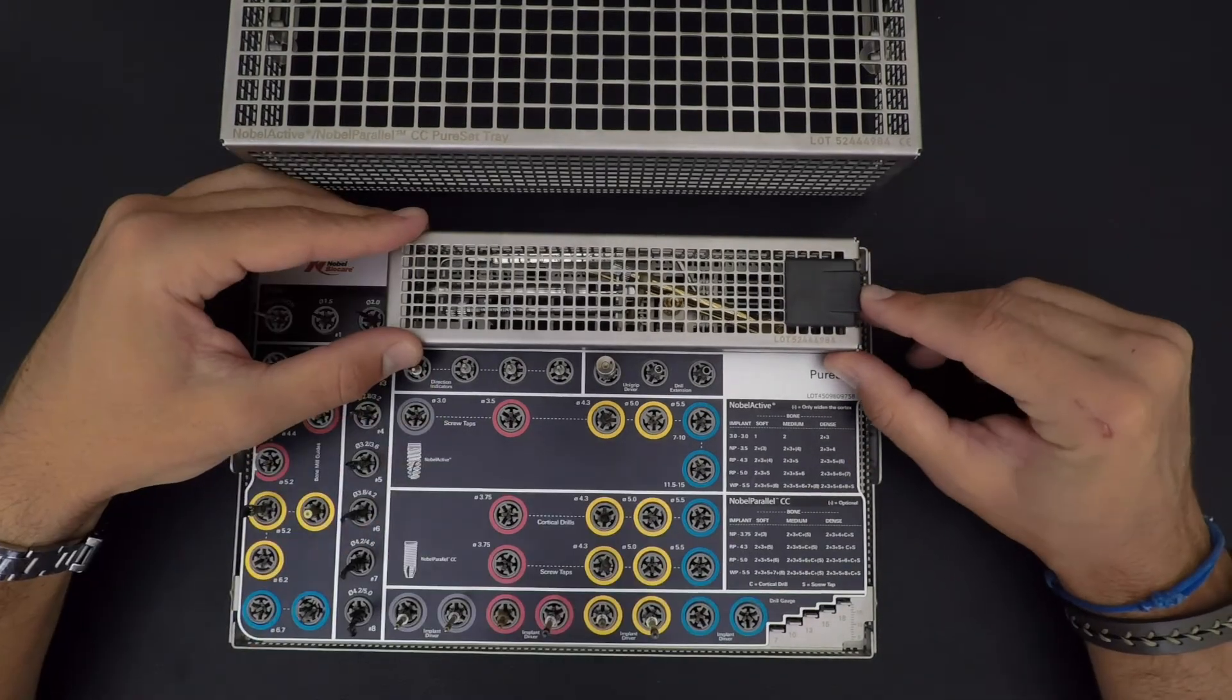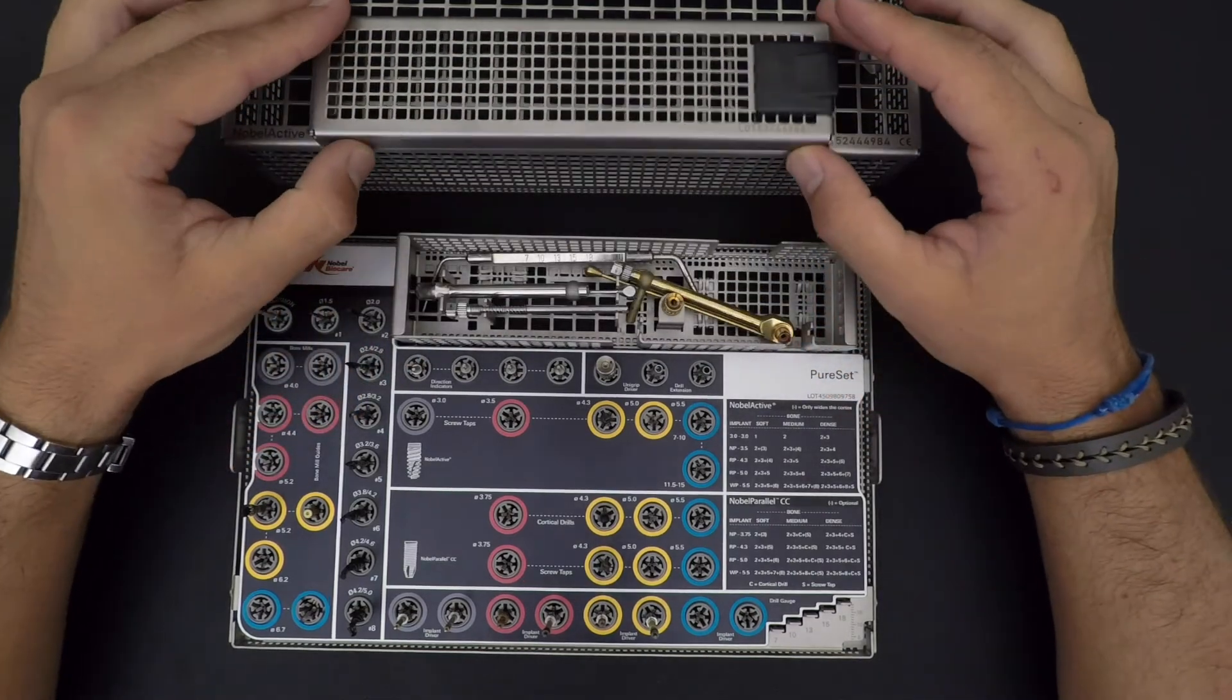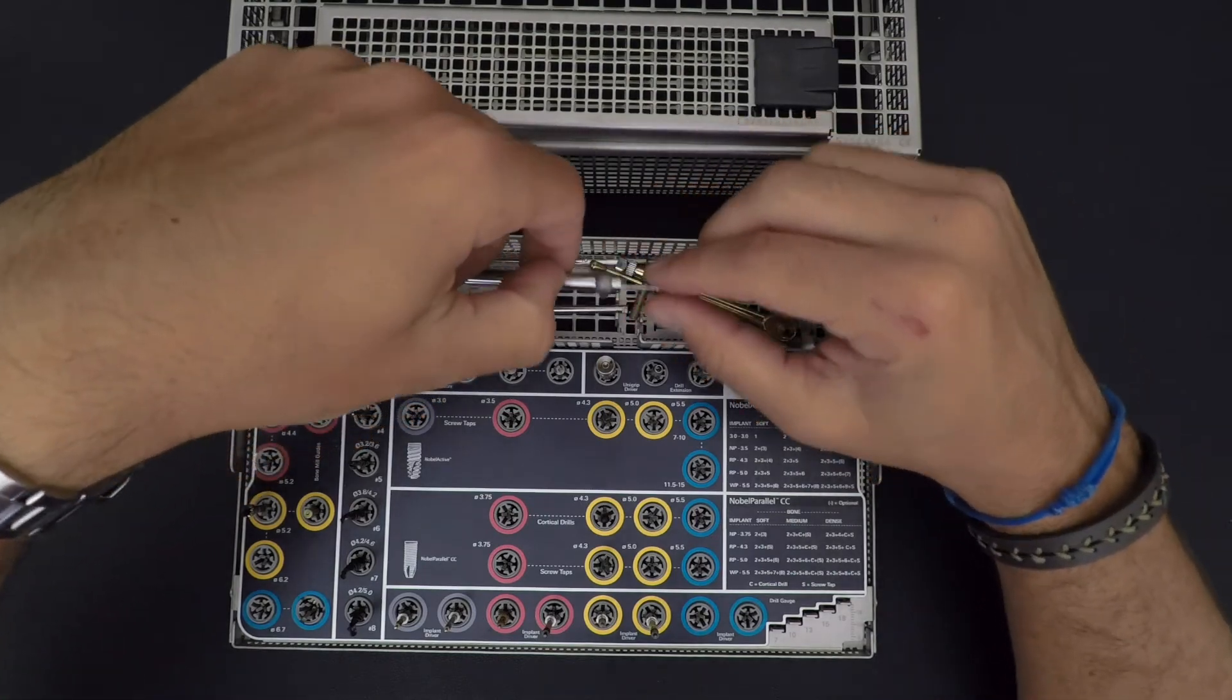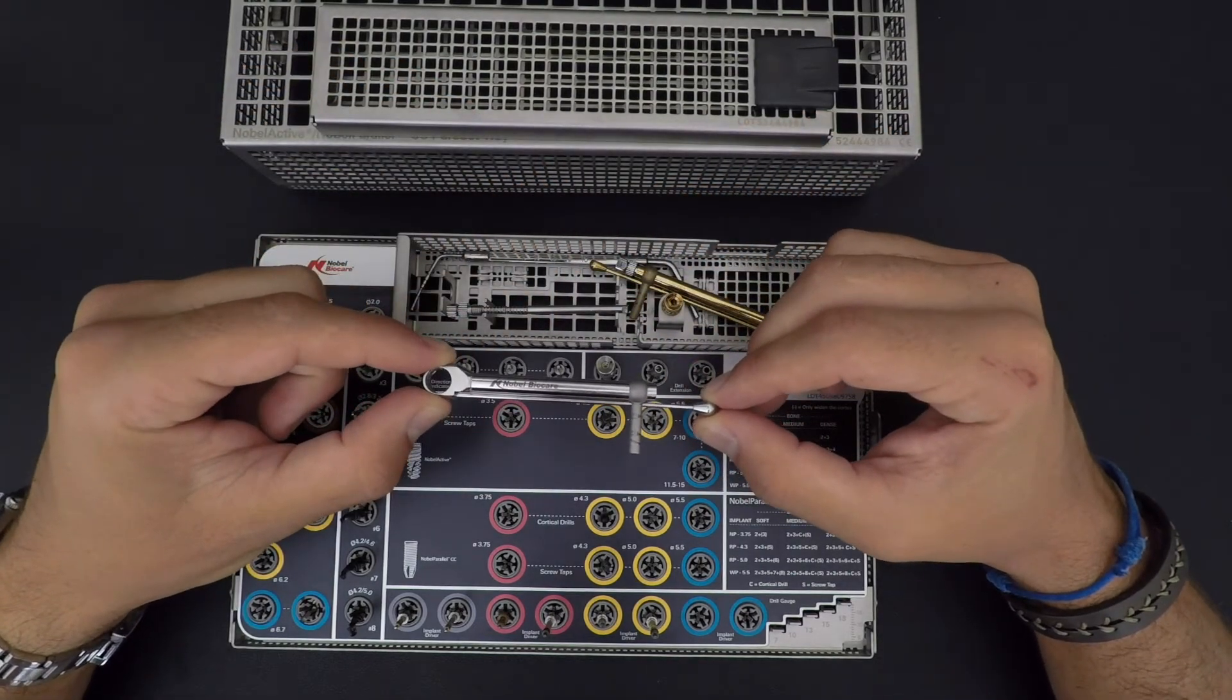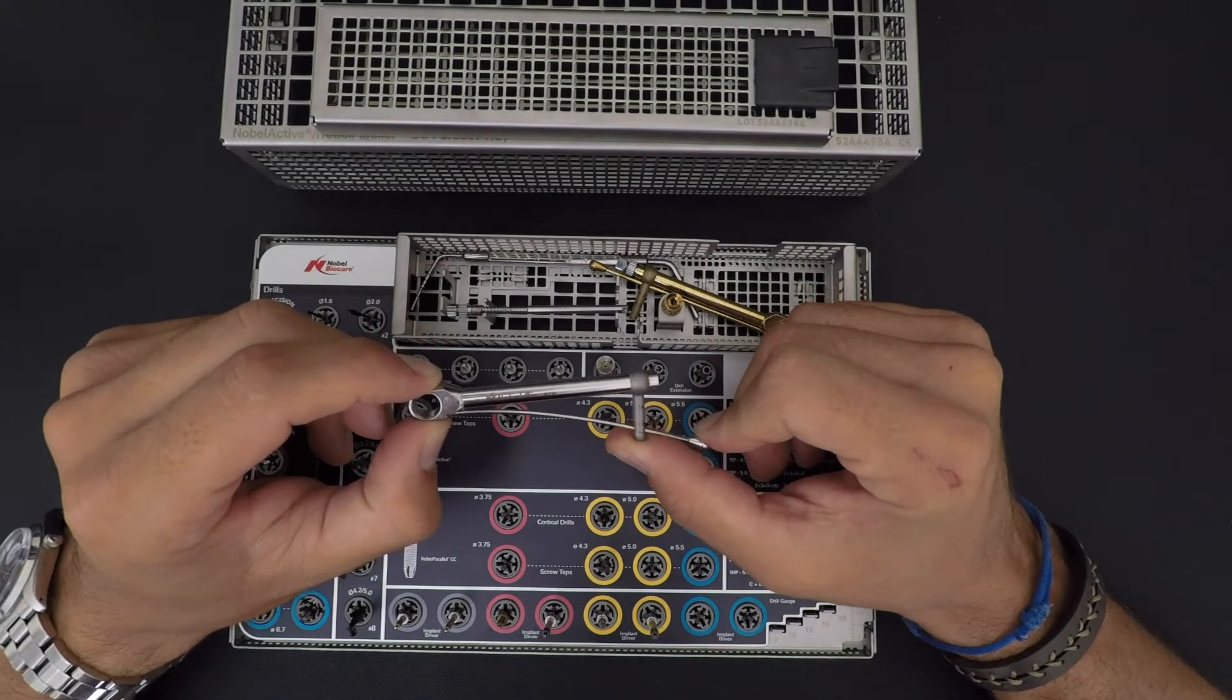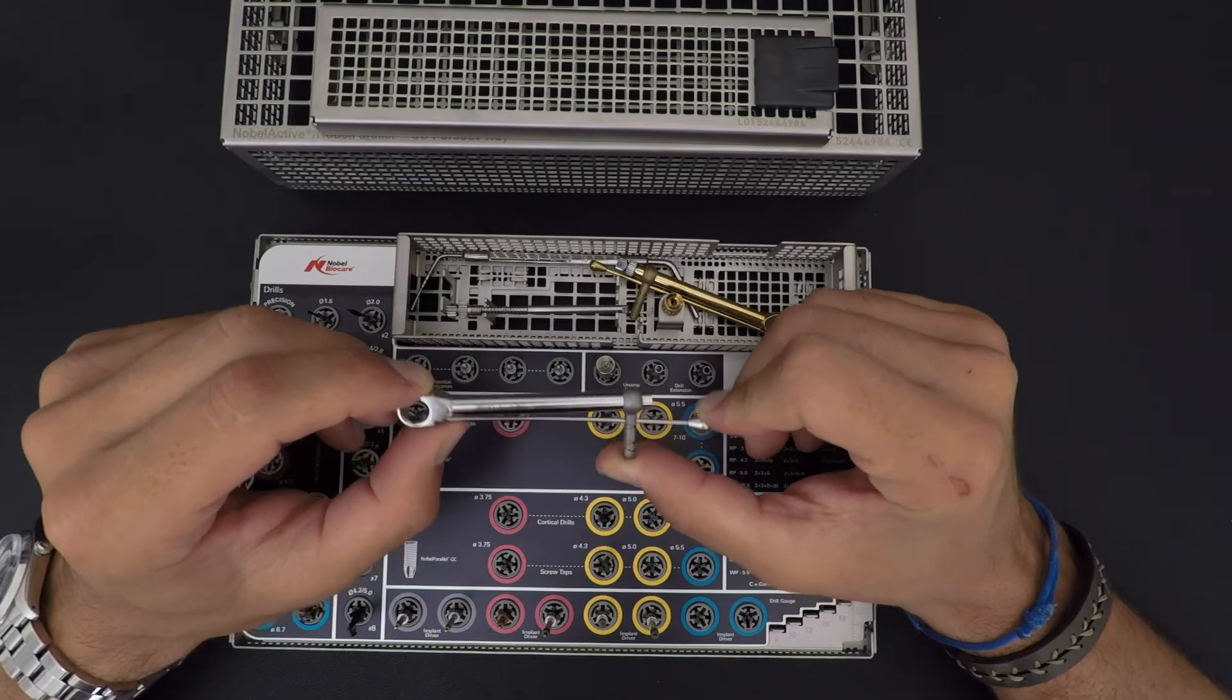Here you got different tools - you got your torque wrench. For Parallel CC, it's a Parallel CC torque wrench because you can torque all the way to about 35, over 40, it might go about 40. Your Noble Active torque wrench - this one torques all the way to 70. The gold is always the Active torque wrench.